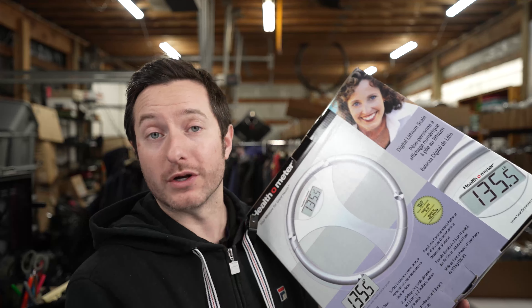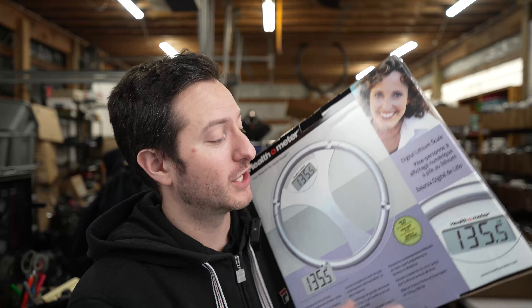If you want to be accurate and look discreet and minimal in your bathroom, look no further than this Health o Meter scale. My wife and I have been using it for quite some time — we really like to keep track of our weight. It slides right under our bathroom cabinet, so it's a great way to keep it out of the open if you don't want to show off that you weigh yourself.